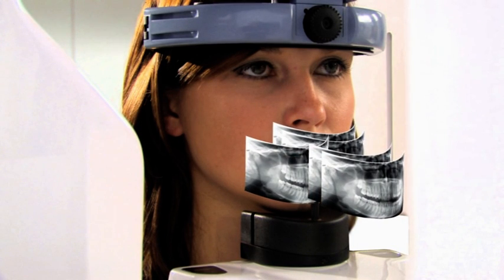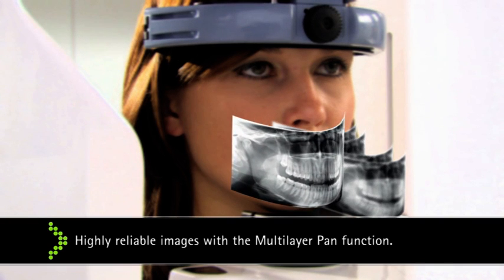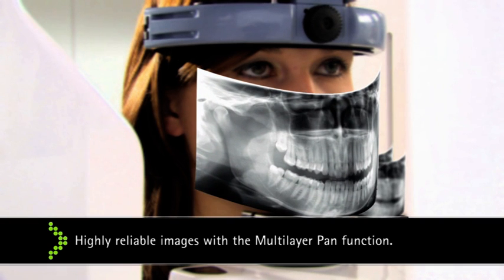Intuitive in terms of image quality. The Carvo Pan Exam Plus is equipped with unique technical system features.